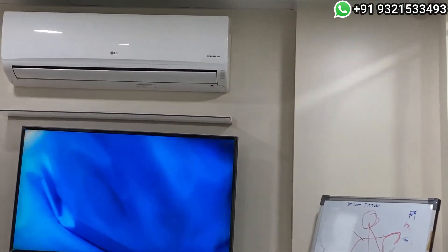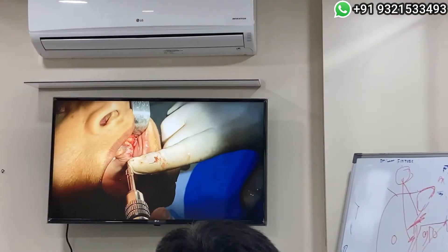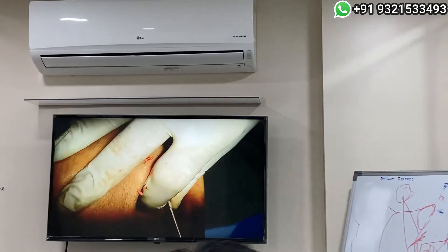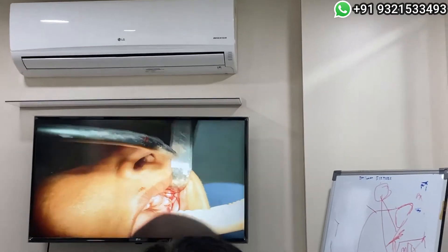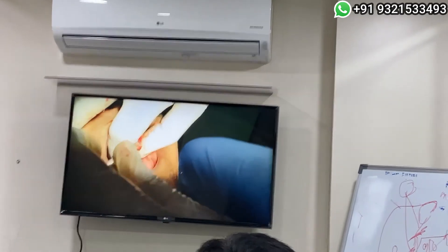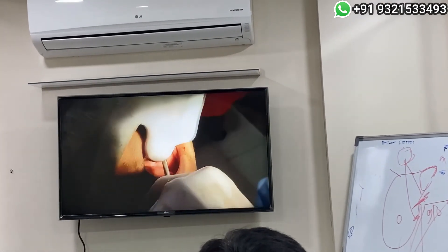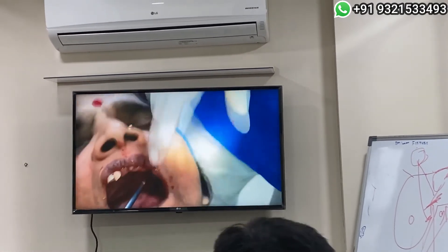This is the 4.0 by 37.5 zygomatic implant. You can appreciate we are now going laterally — can you make out now?